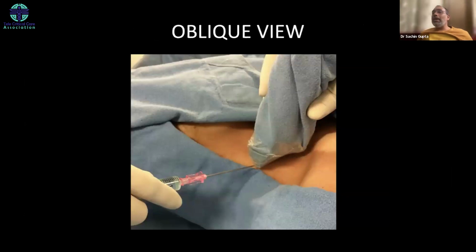The third is the oblique view. Now, this is a hybrid view where you take the advantages of both the views. You take the advantage of the transverse view as well as the long axis view, which means we try to visualize both the vessels.